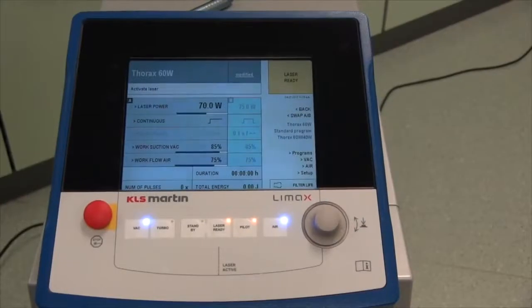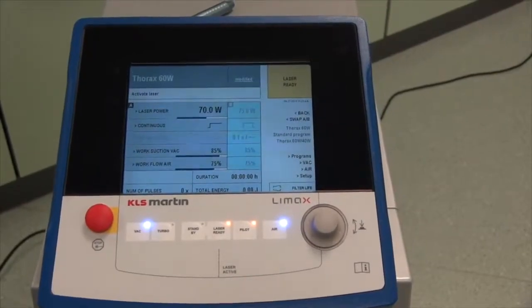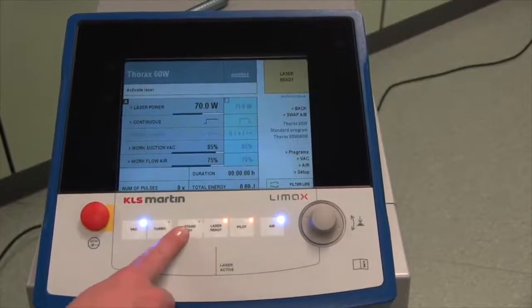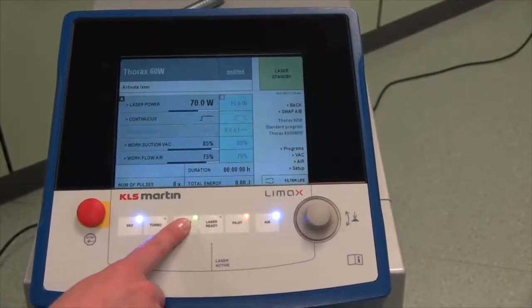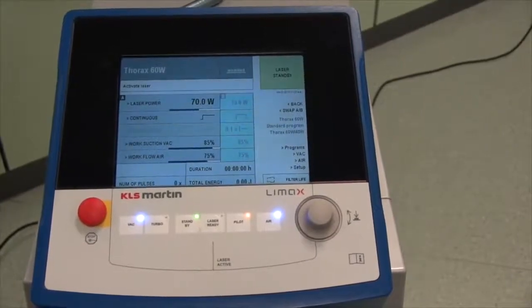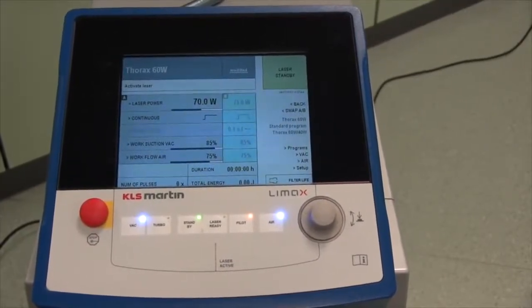When the focusing handpiece or the fiber is no longer used, press the laser standby button so that an accidental activation of the laser light via foot switch can be prevented.